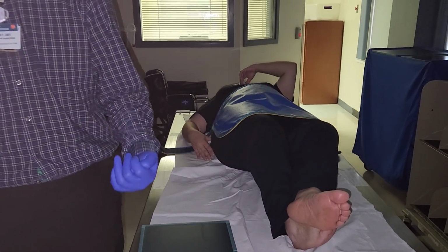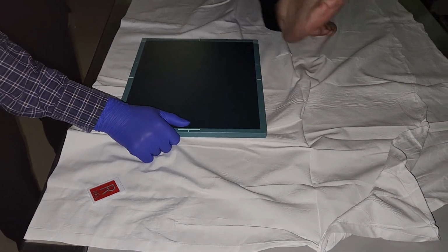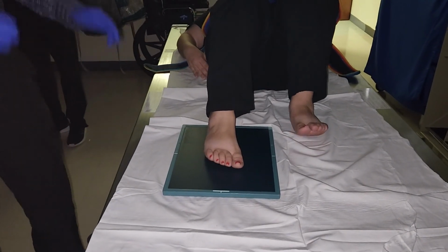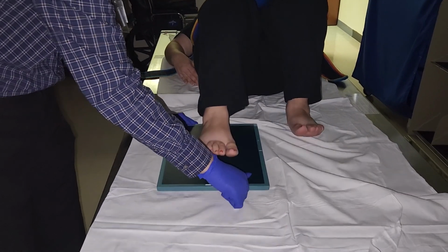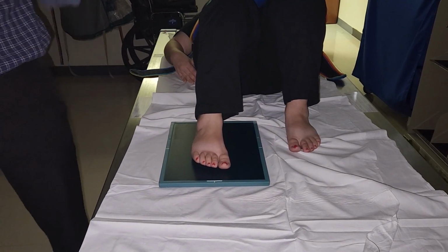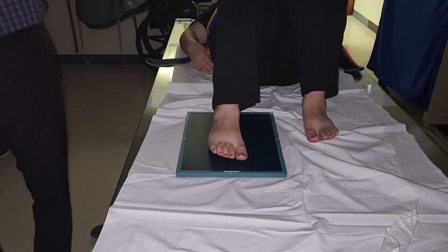Strip is towards the toes. Okay, so Samantha, if you would cross your legs, bend this one foot flat on the board, please. All right, very good. All right, lift up slightly. Good, back down. Okay, so for the foot, we also have an angulation on the AP foot.